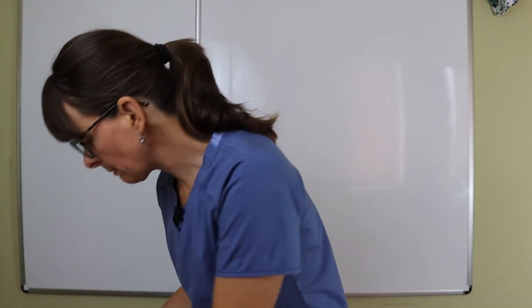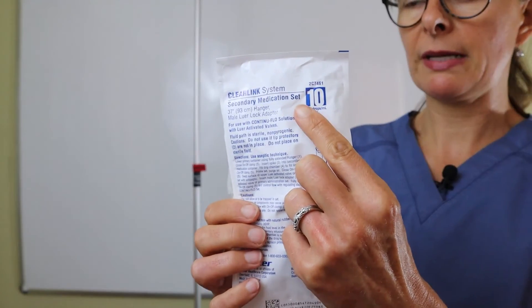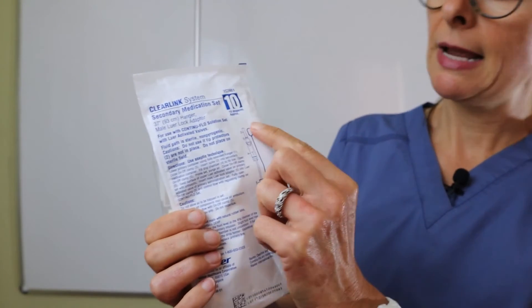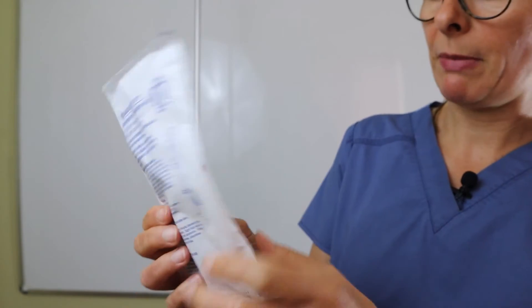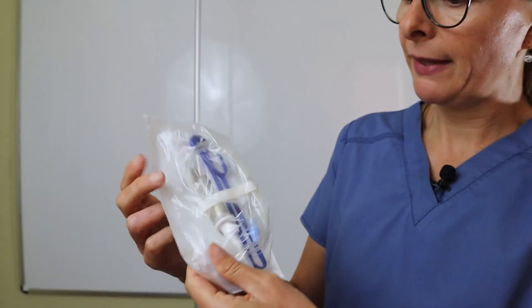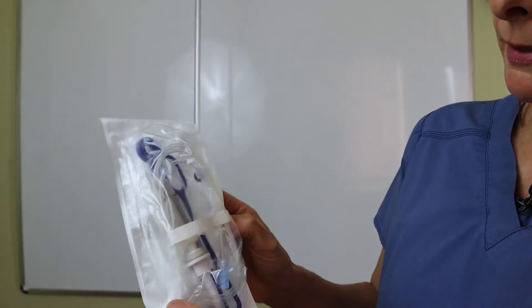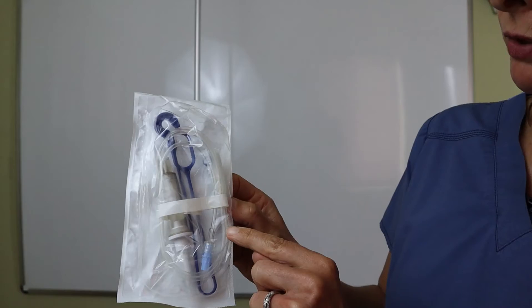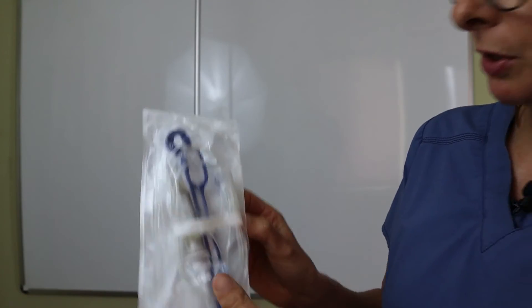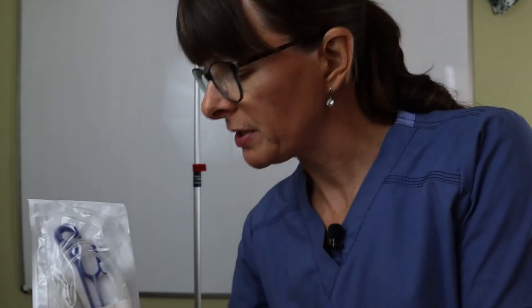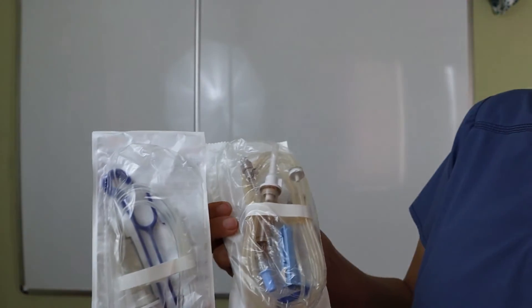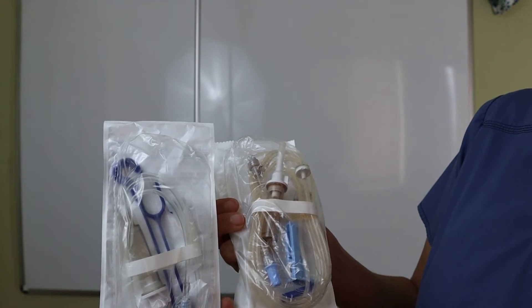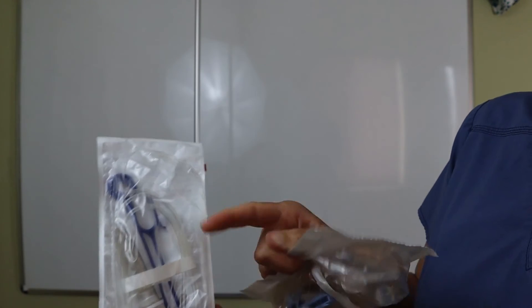The secondary medication set looks like this — it actually says 'secondary medication set' on the packaging. Again, it tells you the drops per ml. And if you look at it, it's much shorter. Taking a look at the other tubing here in comparison, you can see that there's a lot more tubing involved on the primary set.